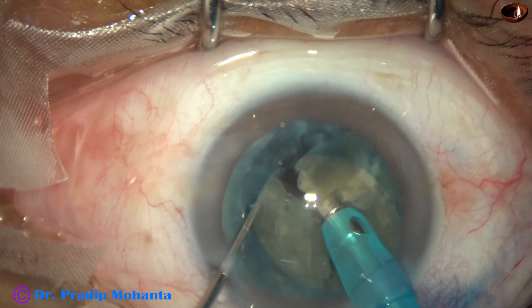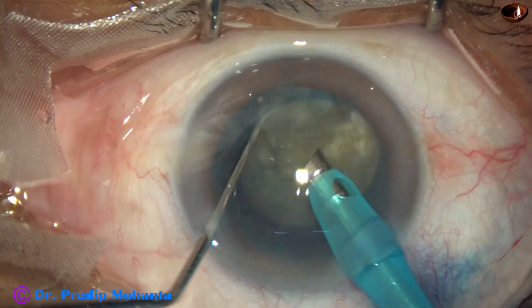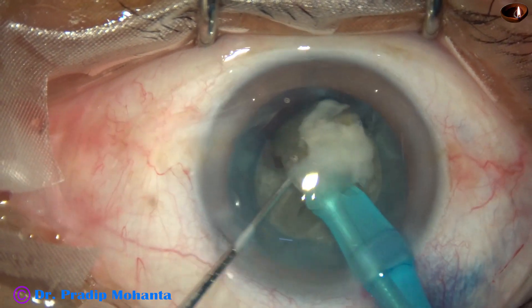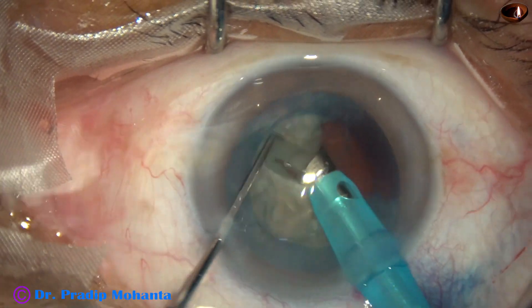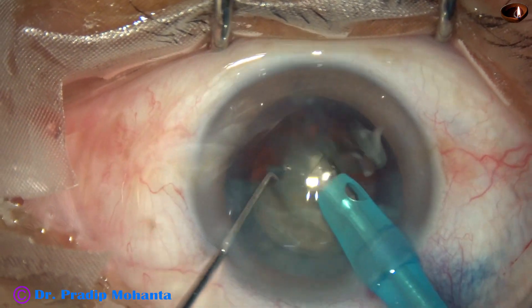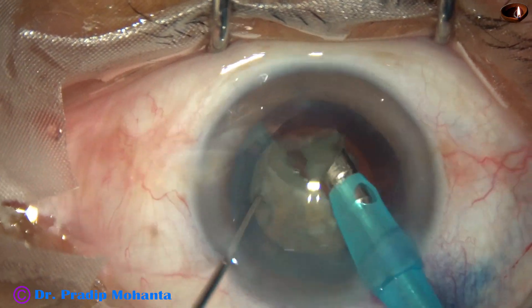When the cataract is hard and the rhexis is small, we have to divide the nucleus into many smaller pieces so that the fragments can come out easily through the opening in the anterior capsule.